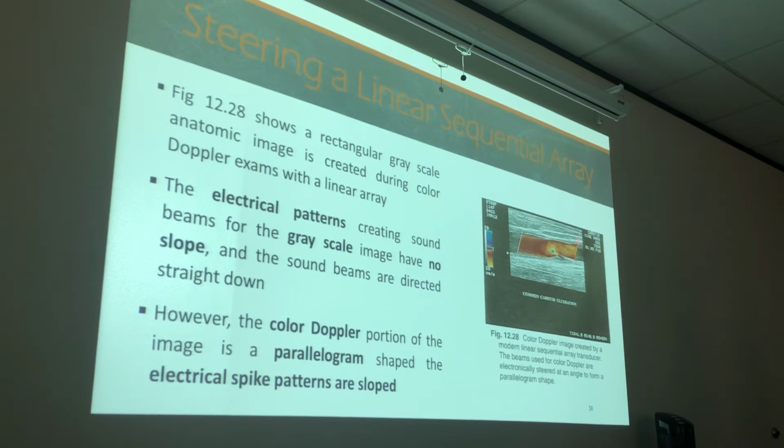Maybe. I don't see the angle on here, because it doesn't have a sample volume in the middle of that, so I can't say exactly what angle that's making. With a sample volume, I can tell you because it's going to be on the screen. I'm not going to make that assumption, but clearly it's angled. It's not in the shape of a rectangle.